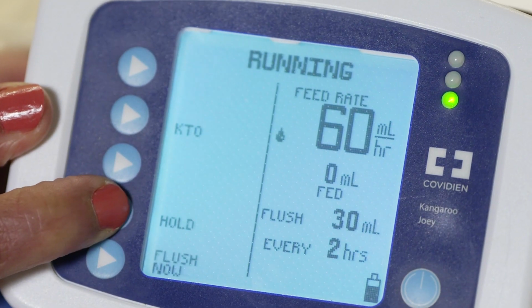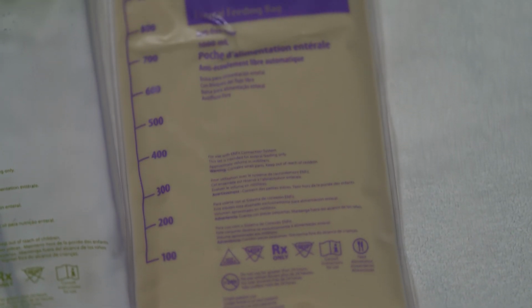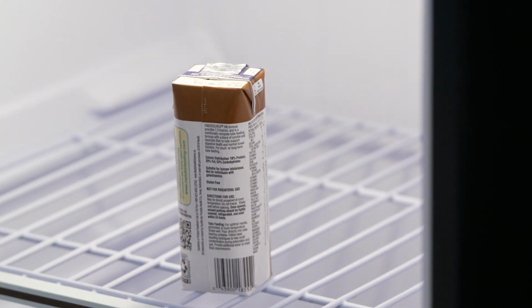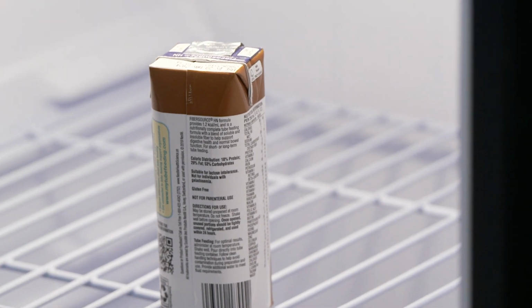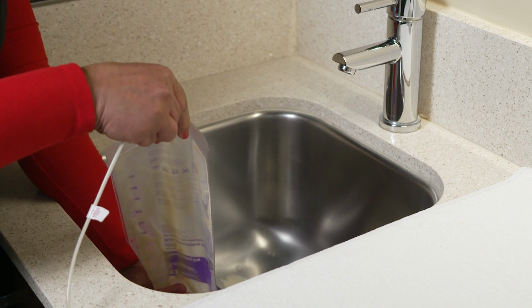Press the Run button when you are ready to begin feeding. Formula in the feeding bag is good for only 12 hours. Cover or reseal and refrigerate unused or opened formula. Discard any formula in the feeding bag after 12 hours.